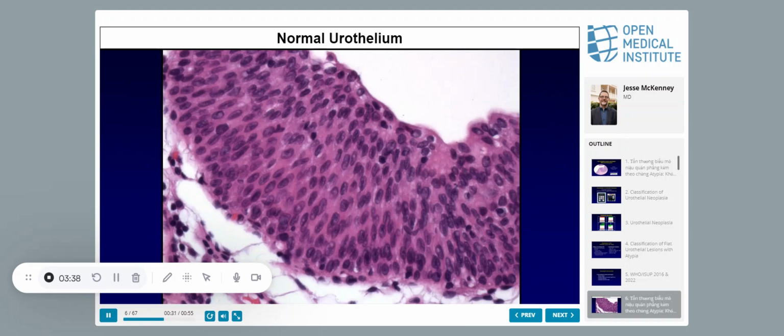The nuclei are often elongated. Okay, they're not rounded, they're elongated. And they often have little grooves. It may be hard to see them in maybe one or two, but this is pretty normal. Now obviously, if you get the section cut too thick, they look a little darker, so there's going to be a lot of variation from stains and thickness. But this is about normal.